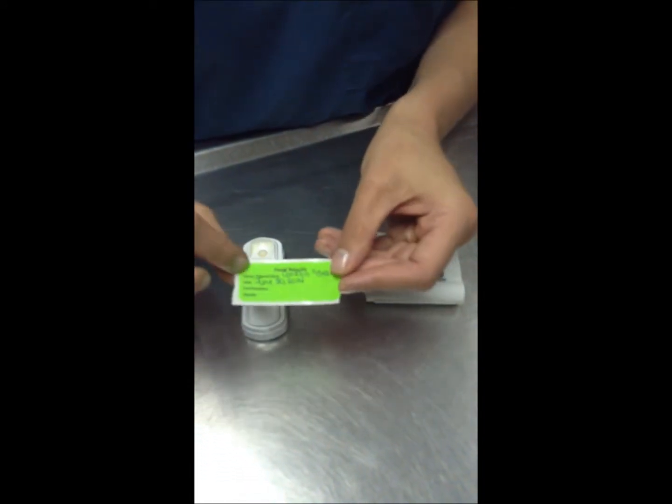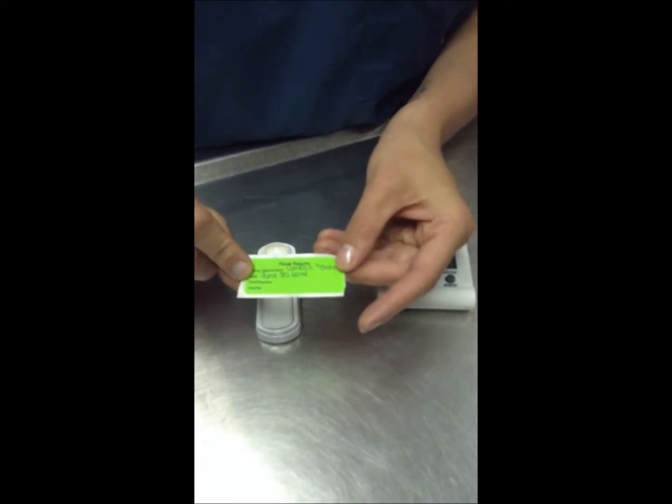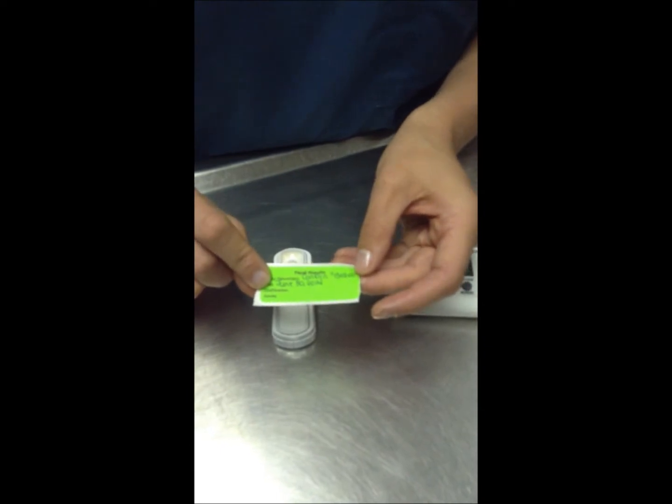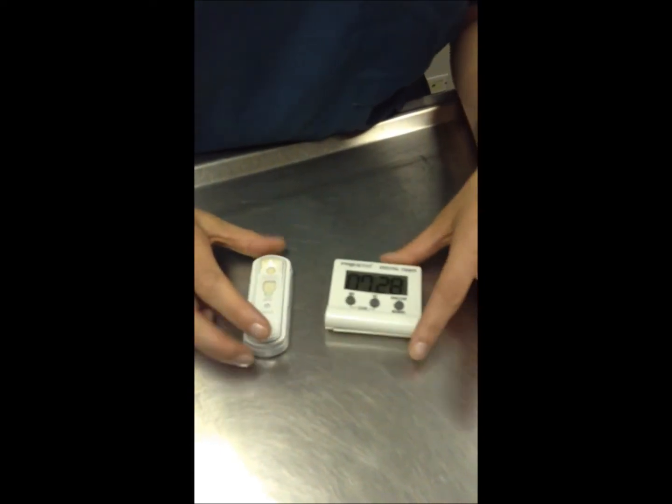We also have little stickers for our files that has the patient's name and the results and whether or not we're gonna be sending out a stool sample to the outside laboratory. So when that's done, we just will monitor the results and just record them and put them in the file.